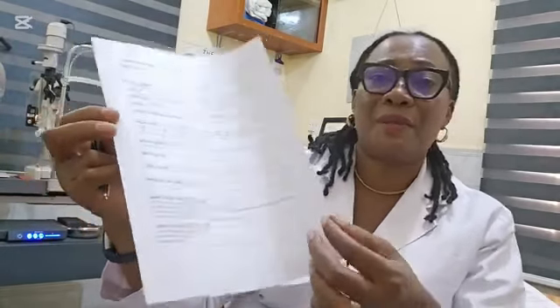She can sit in the front row in class, and then bring reading material closer. It gives proximal magnification. There is nothing wrong in her doing so. So we proceed for the cycloplegic refraction. So this is the low vision evaluation form that we use to do the assessments. Thank you.